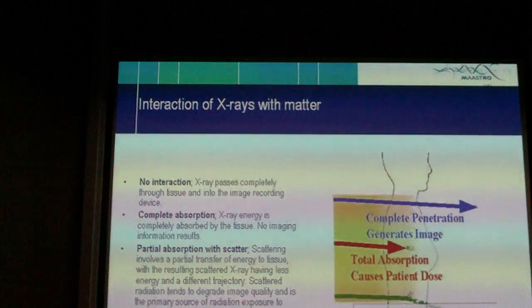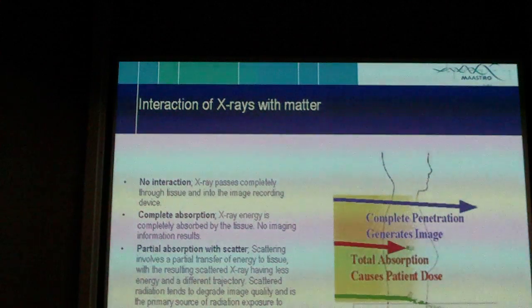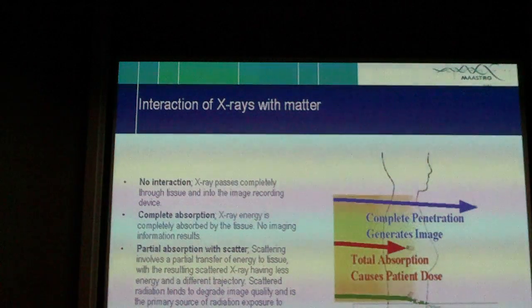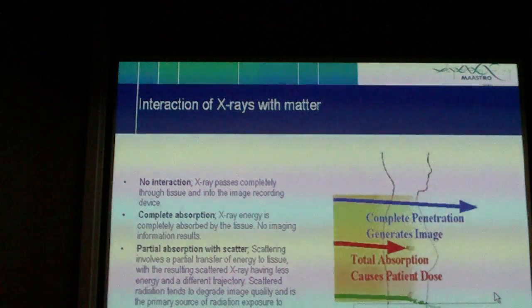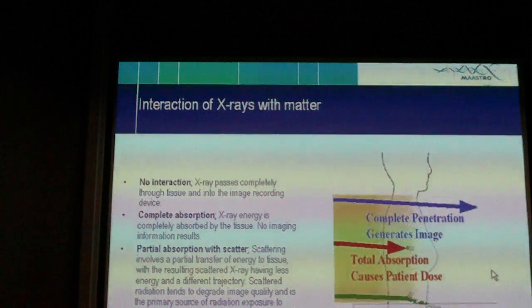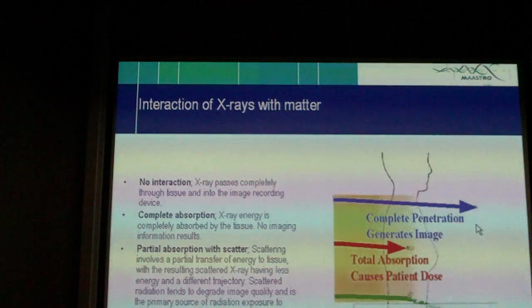It's also a problem for the patients themselves, and also for the staff members or technologists who treat the patients, because usually they don't see these scattered photons. They go in any direction except a straight line, so it's hard to control for that. Also for that reason, the linacs in our institute are placed in bunkers. We have walls of more than a meter of concrete with steel inside, just to stop these scattered X-rays.